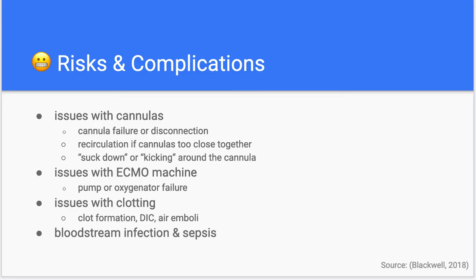We've talked about recirculation. If the cannulas get too close together, then you're just sucking out the blood that you just put back in and it's not getting to circulate through, so that can be another thing you need to watch out for.